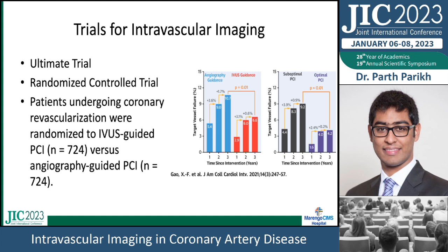A randomized controlled trial looking at patients who underwent PCI with IVUS guidance versus just simple angiography. And we can clearly see that the target vessel failure in patients who underwent IVUS guided PCIs was significantly lower over a period of 3 years compared to those who just had the PCI done based on angiography.